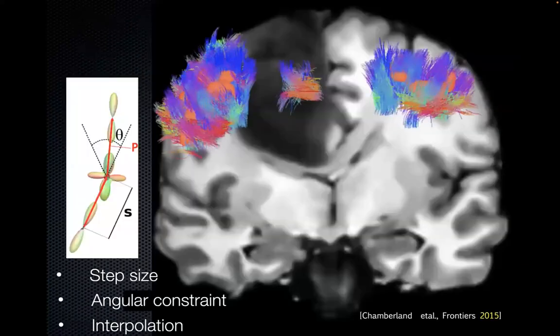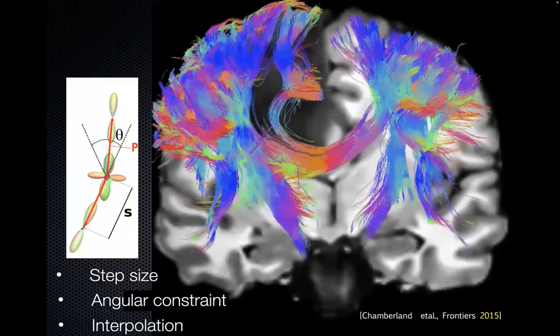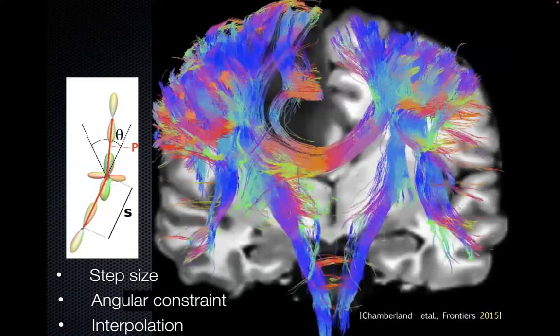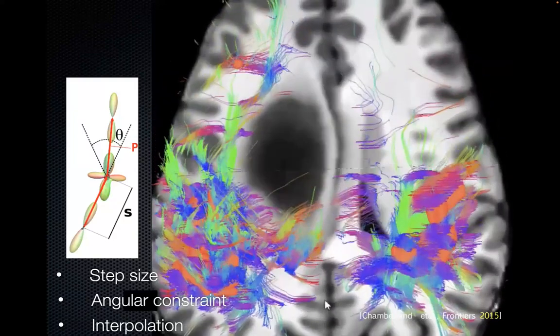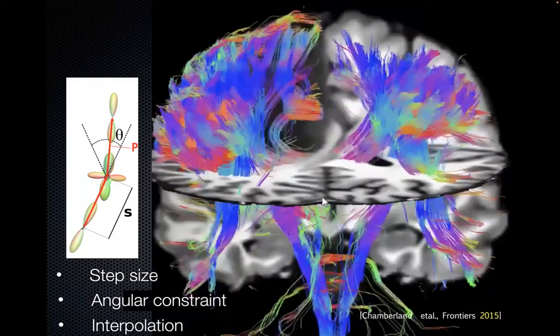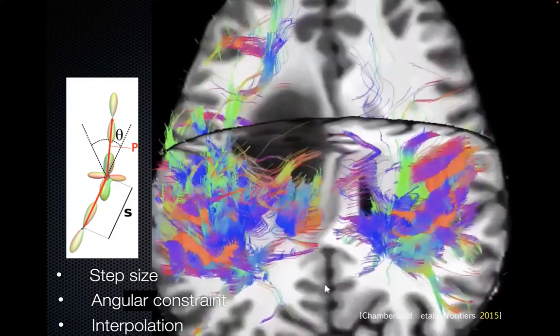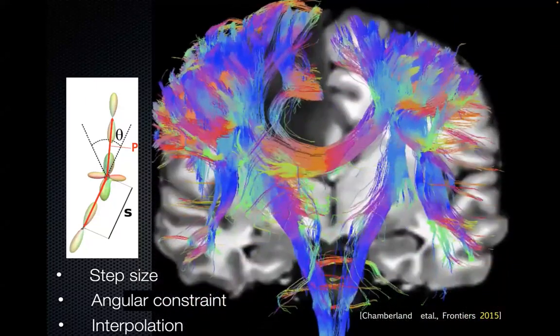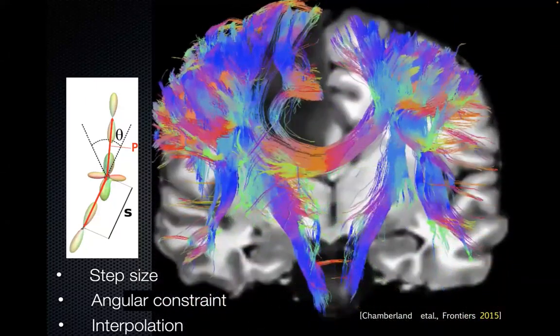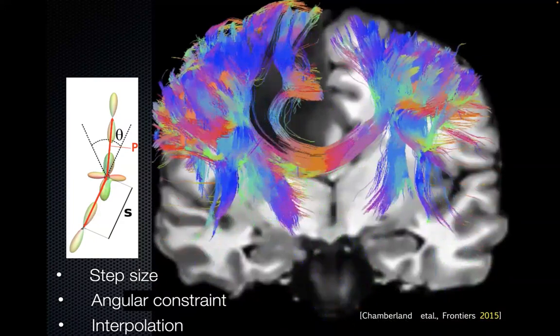I need to accelerate a little bit. And so that's an animation. Here, in fact, this is a functional MRI seeding strategy. You'll see the blobs later. But I actually started from a motor task fMRI activation. I'm going to play it again. You can see it's dirty also. Now I'm moving backwards. But this is just putting a seed at every point at the beginning and just following the pixels until I step out of white matter.